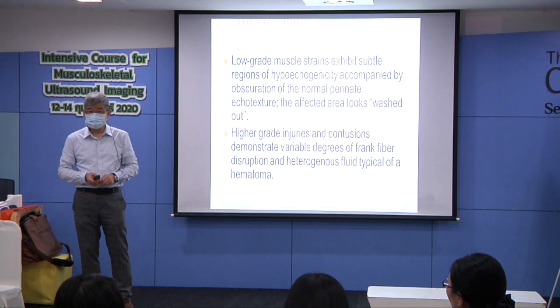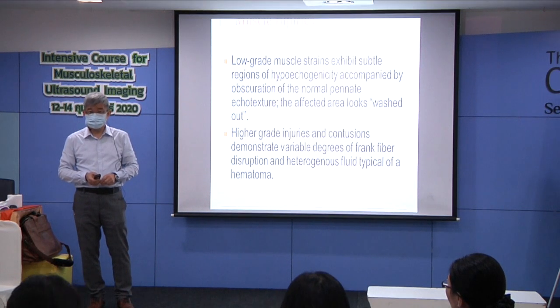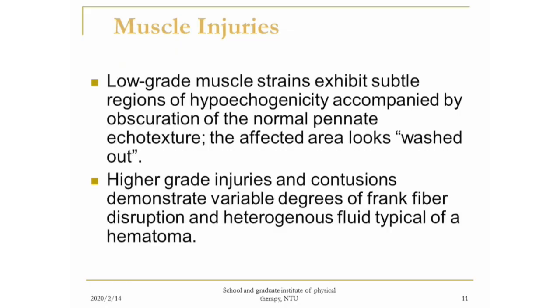Okay, so in that case, the only solution is to find a high resolution probe. If you are looking at a tiny or small injury, try to find a better probe first. If you cannot have one, then try to use the dynamic range. But sometimes it may not be functional.